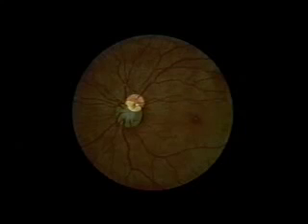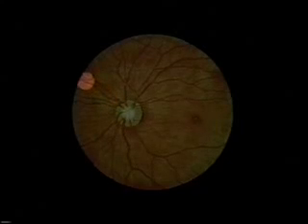Normally, the disc is yellowish-orange to creamy pink and round or oval with well-demarcated margins. It may be surrounded by white or pigmented rings or crescents. The optic cup-to-disc ratio is usually less than 1:2. Moving your head and instrument as a unit, inspect the retinal vessels and adjacent retina by following the vessels from the disc to the periphery in 4 directions.